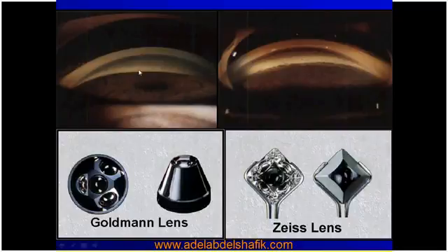Here, with the three mirror contact lens, we cannot do any indentation because of the corneal diameter. The angle details are not seen. On applying the Zeiss lens or the Posner lens and doing indentation, the trabecular meshwork became apparent, so it's an actual case of appositional angle closure.